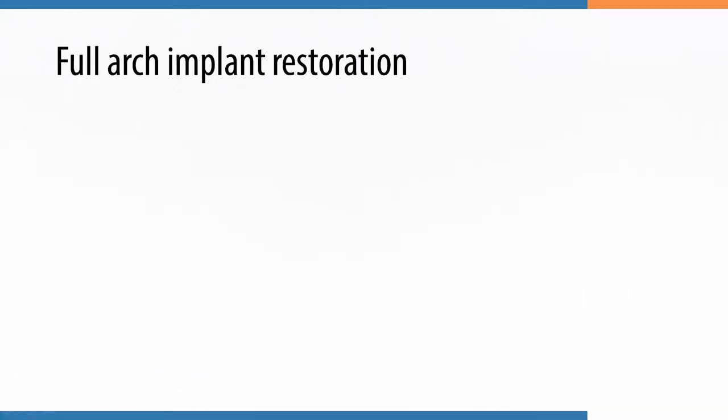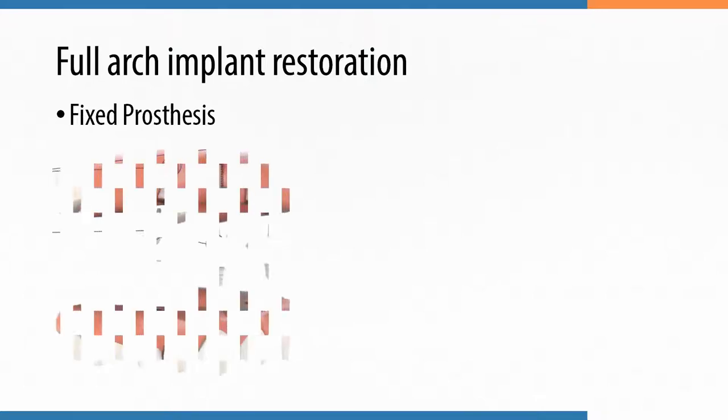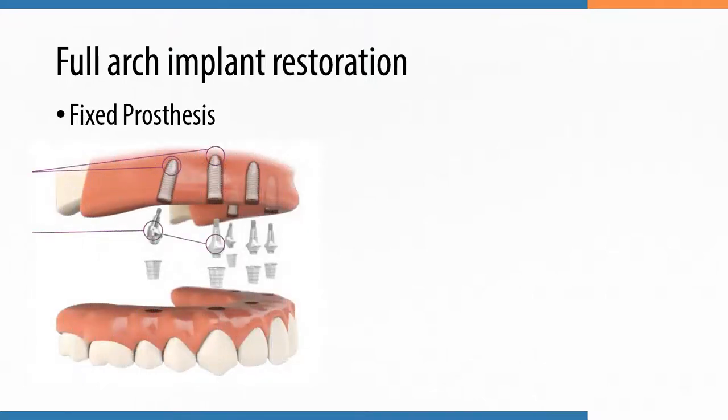When it comes to implants prosthetics, you can restore the patients with a fixed type of prosthesis, whether it's an FP1 restoring the crown only, an FP2 restoring the crowns and part of the root, or the more common for full arch edentulous patients, which is an FP3 type of prosthesis. You need to plan before you start, once again, as the transition line between the restoration and the patient's gums should not show in an exaggerated smile.